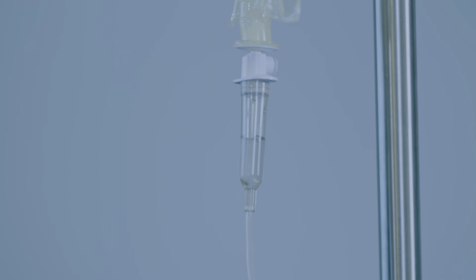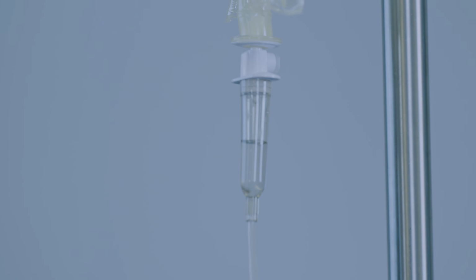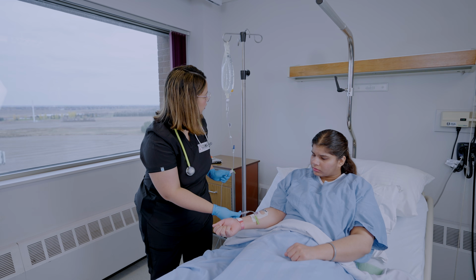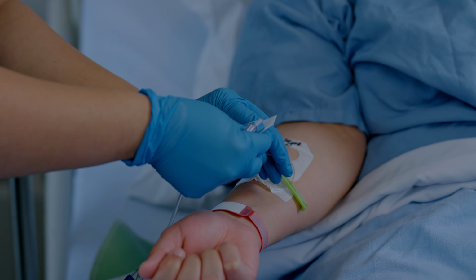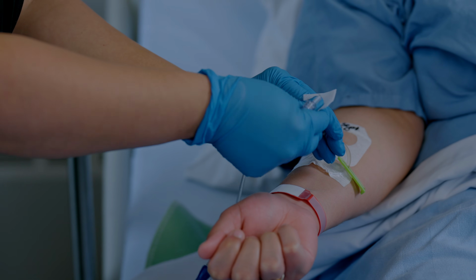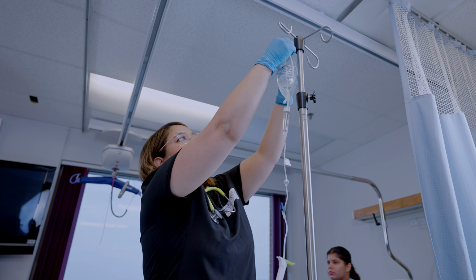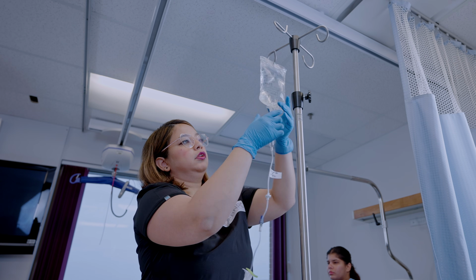Now, when you're happy with the 21 drops which are flowing through the drip chamber, you're going to hook up your tubing to your patient and let it run. Before you connect that IV tubing to the patient's saline lock, you want to clean that port for 30 seconds. So I hope you enjoyed learning this very simple method of how to attach the IV fluid via gravity.